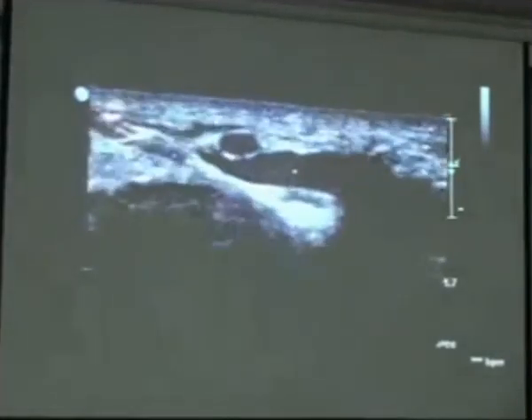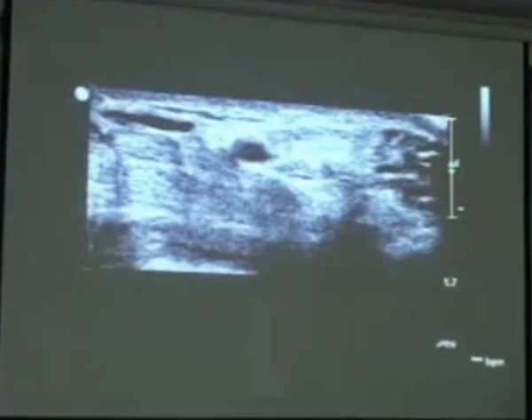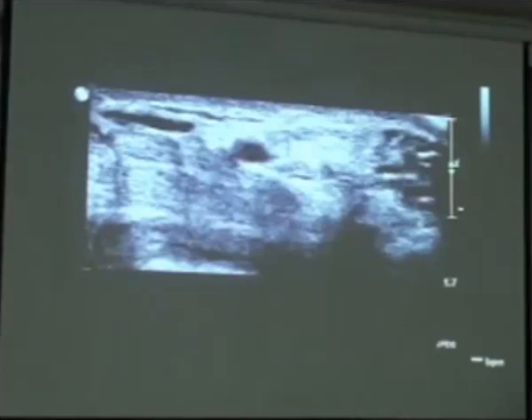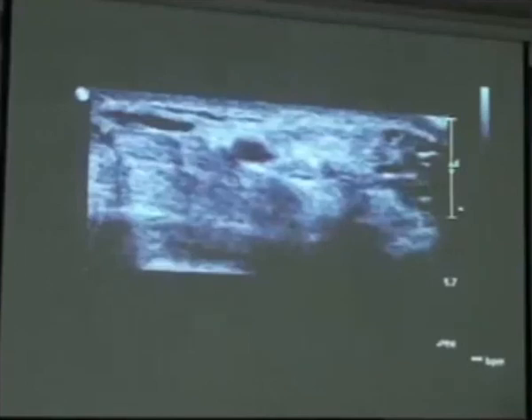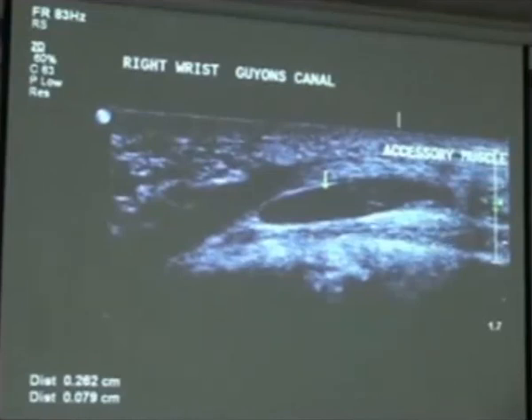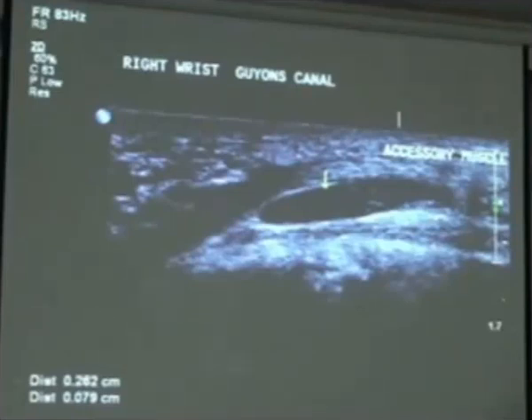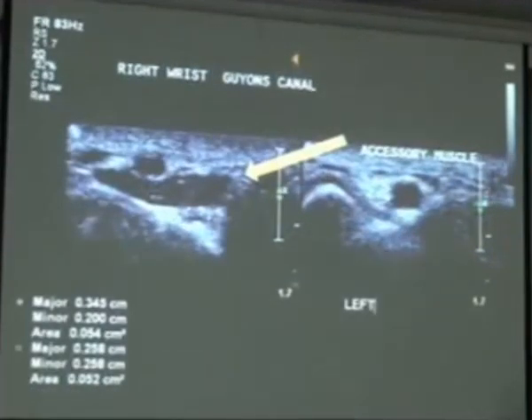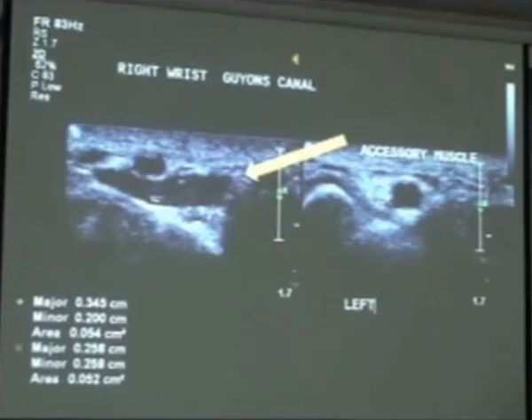In this patient, we found an accessory muscle coming down and compressing on the ulnar nerve as it enters the wrist. This is the accessory muscle sitting here with the nerve underneath — the compression is caused by this accessory muscle. Using split-view or dual imaging, you can see the symptomatic right side with the accessory muscle alongside the artery, compared to the asymptomatic side with the normal artery and nerve.